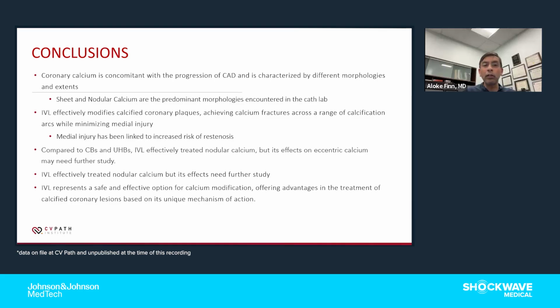IVL effectively treated nodular calcification, but its effects really need further study. I think it represents a safe and effective option for calcium modification, offering advantages in the treatment of calcified coronary lesions based upon its unique mechanisms of action. So with that, thank you for your attention.